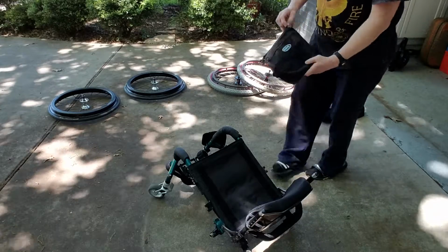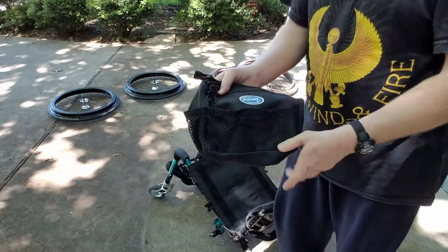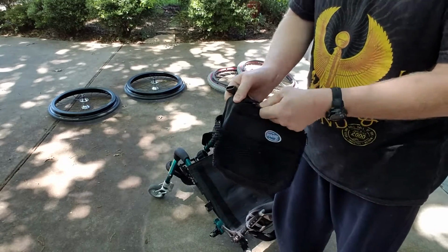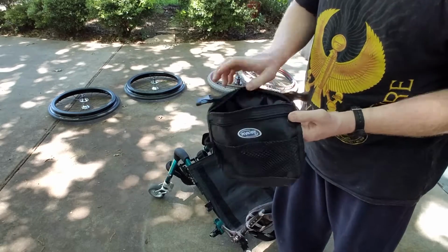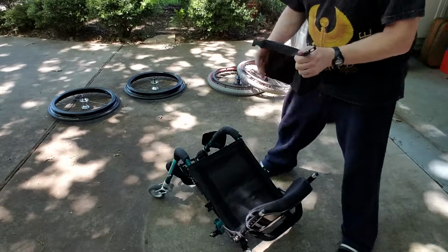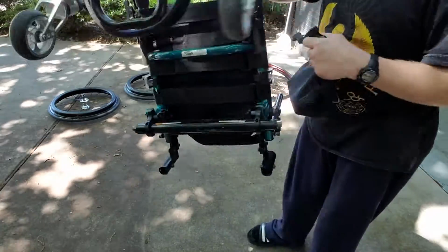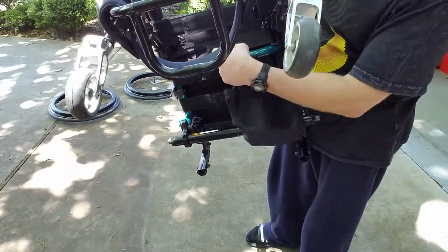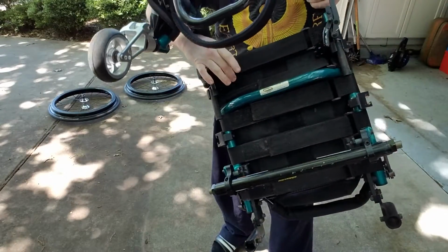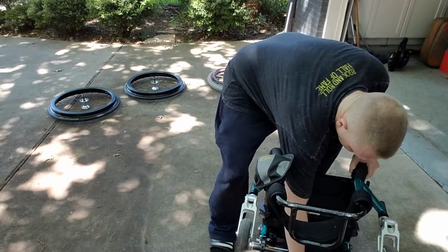There's also another bag that you can put stuff in. It's got some pockets and little zipper components inside. What this does is it attaches to the bottom of the wheelchair. It's got two little clips right here. Those attach to these right here, and they just clip in real easy.